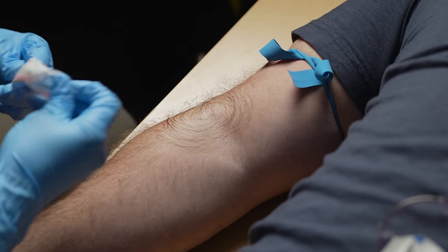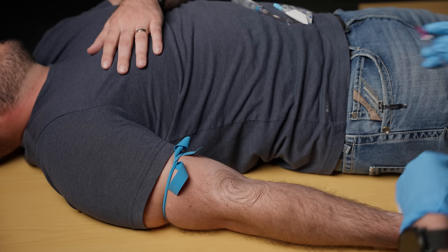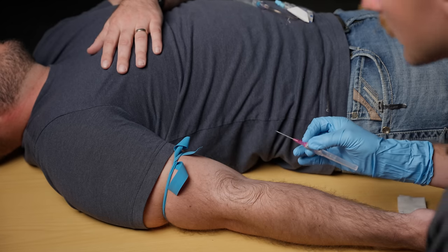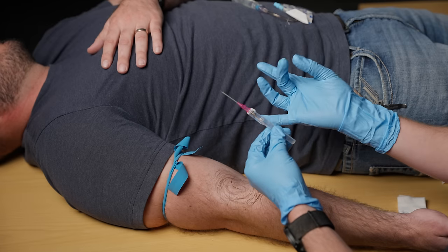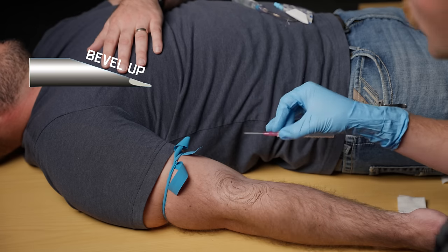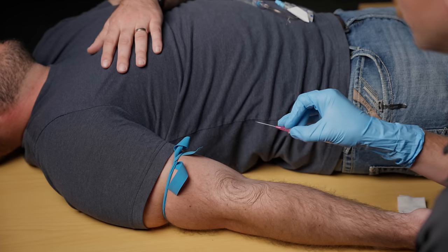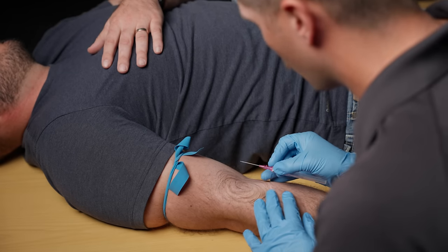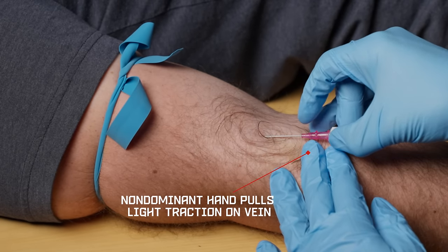Now I'm going to take my IV catheter — you can just rip these out the back, that's probably the easiest way to do it. I'm going to make sure this catheter is out and ready to go and usually I'll just slightly move that hub to make sure it's free — sometimes they freeze up and it's harder to feed in. When I hold this catheter my middle finger and thumb pinch it and my pointer finger rests kind of on that hub to direct it. The book says to insert at a 45 degree angle but I feel that's a little too steep, so I go a little shallower and level it off once I get in.